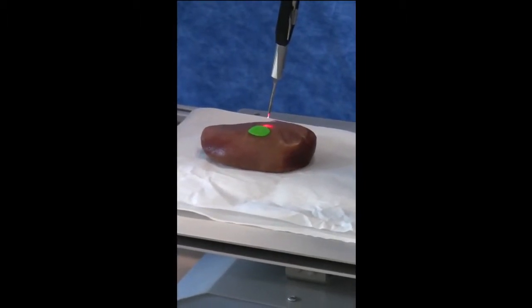The green dot represents a tumor. In kidney cancer surgery, we frequently remove just the tumor itself and leave the kidney behind so that the patient has as much renal function as possible.